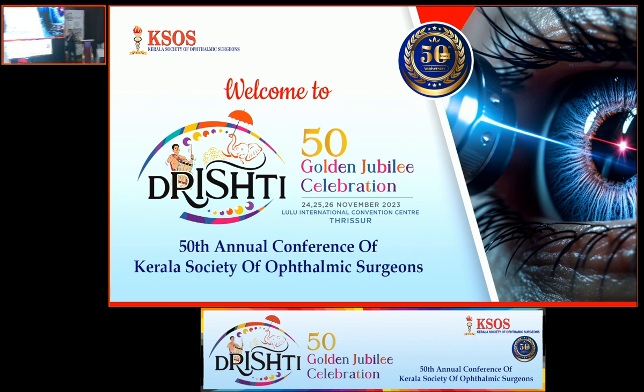The good news is that the modern multifocal and trifocal lenses which have come have a larger central optic zone. Because it's a larger central optic zone, you can even go up to an angle alpha of 0.8 theoretically and still do well. So that is one thing. Many of them are coming with a larger central zone. But unfortunately, the Hoya, if you see, it is much smaller than what we are having already. So we'll have to be a little careful.